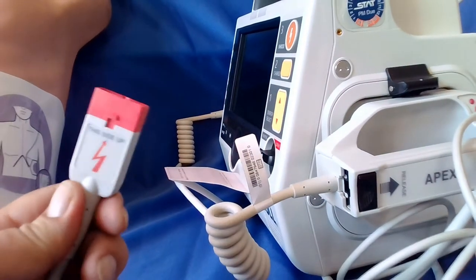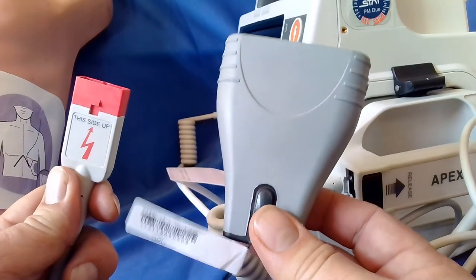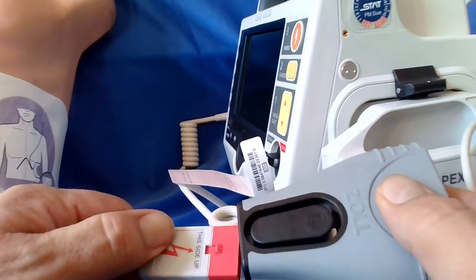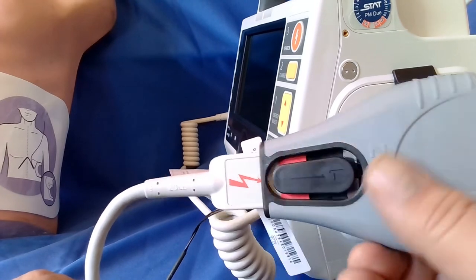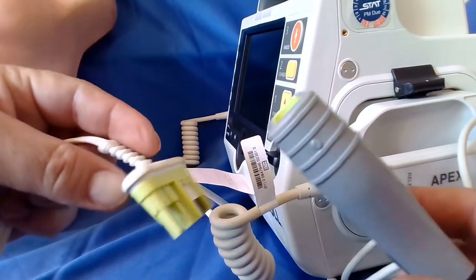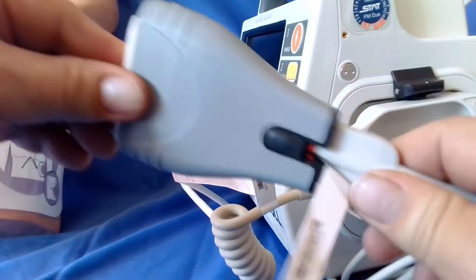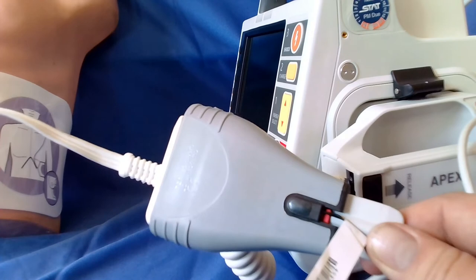the pedals, and you'll see that on your cable is another little puck. This is your CPR feedback puck. So we connect this top out. We slide in, and once again we've got a click on that side. We then take the other end of our pads and we connect it to the puck. An important thing to remember, this provides the CPR feedback from your pads to the device.